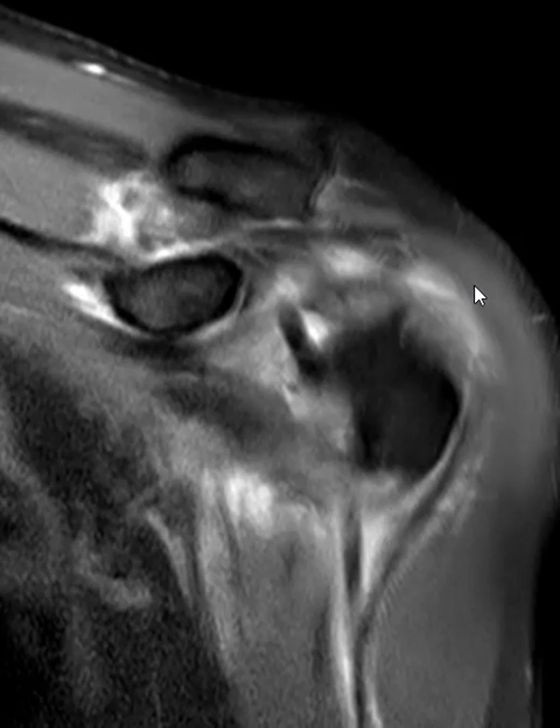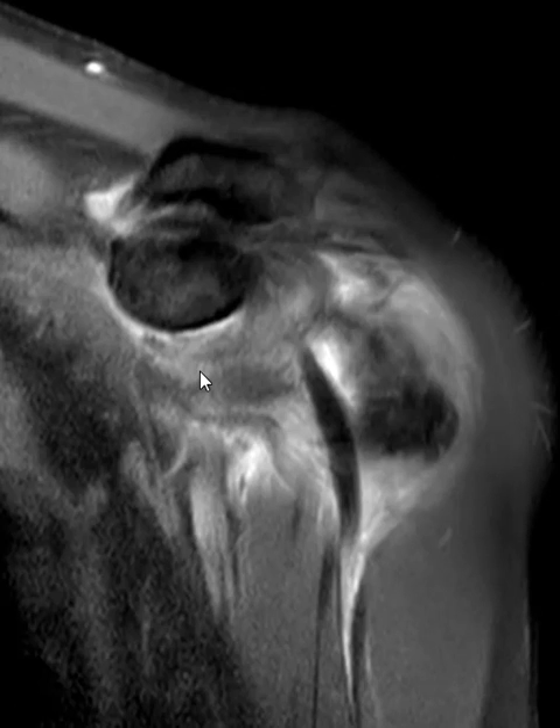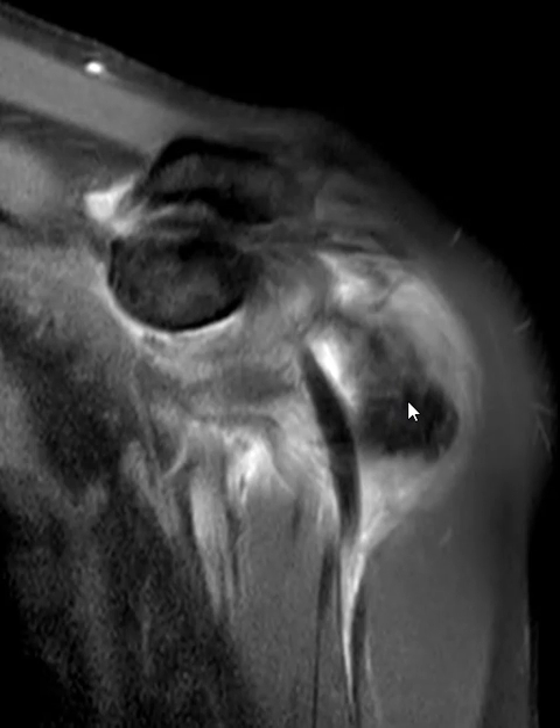If we move forwards, we see that the subscapularis tendon over here also has a tear. We don't see the broad subscapularis coming across, and this is the lesser tuberosity. We don't see the broad tendon there, so they have a large tear of their subscapularis tendon as well, and we see this coming across.